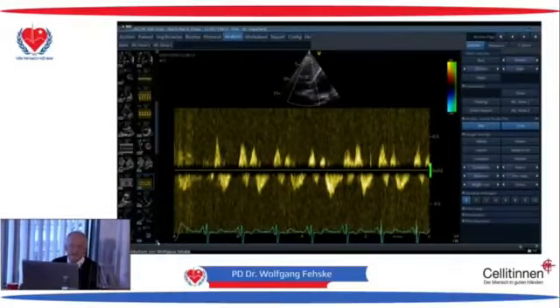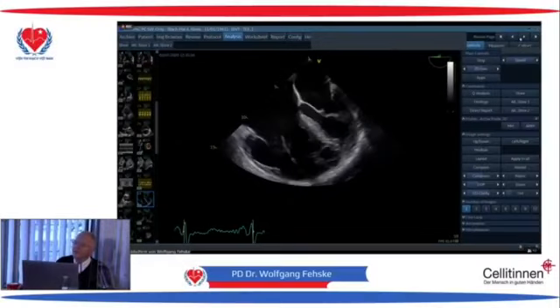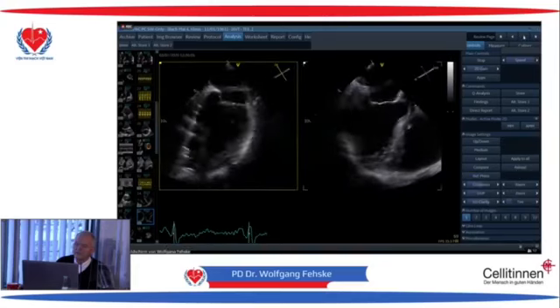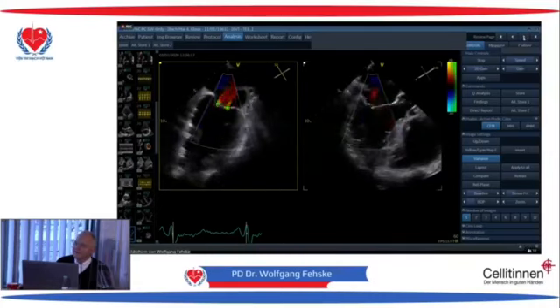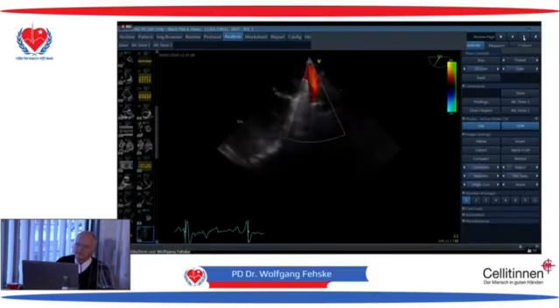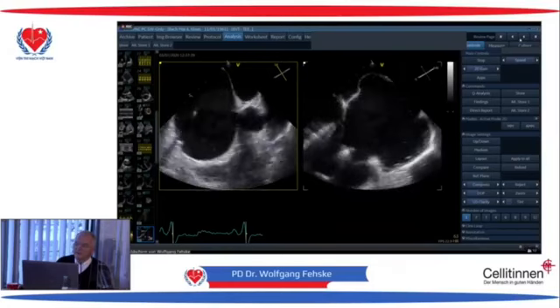And we decided to complete the diagnosis with TEE. We go quickly through it. You have seen it a minute ago from Dr. Ducoq, a very tiny mitral regurgitation. We do it routinely. This is nothing specific. And then we go to the interatrial septum.